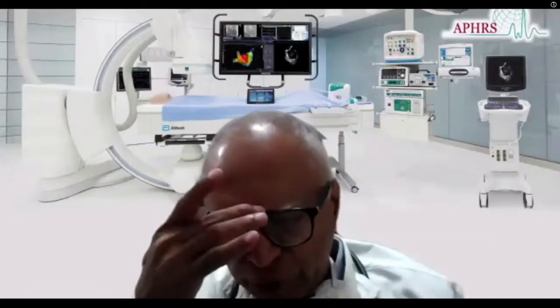So if you have done everything and still the tachycardia is not inducible, one of the important points is to look at the crossover. The Wenckebach cycle length from the atrium is a manifestation of the property of the slow pathway. If you have successfully ablated, the Wenckebach cycle length should prolong significantly, and the crossover should be abolished.